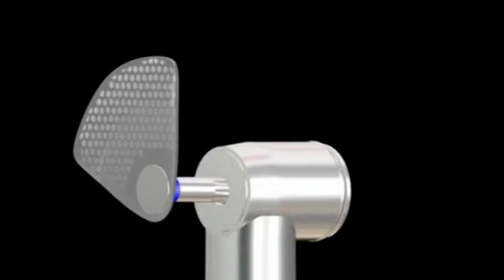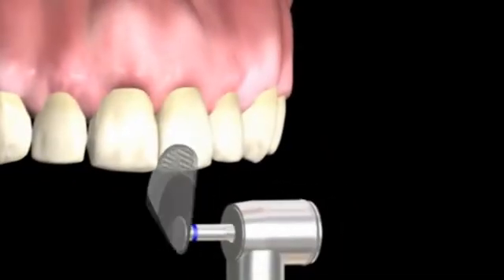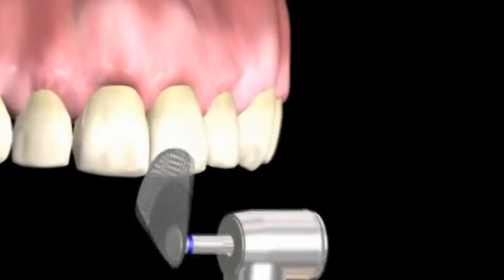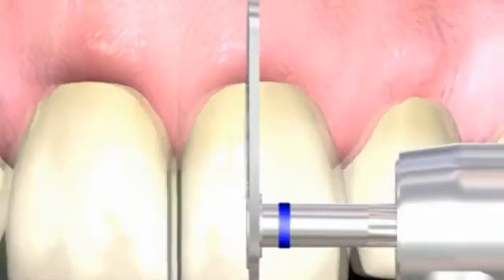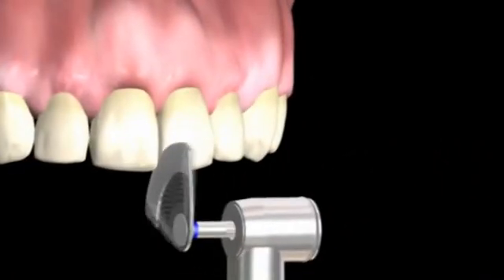There are 8 positions which allow for optimal access in lingual and buccal areas of the mouth. The risk of injuring the soft tissue is virtually eliminated when using OS30. It's more comfortable for the patient and safer — it reduces the risk of gingival injury and results in less time in the chair.